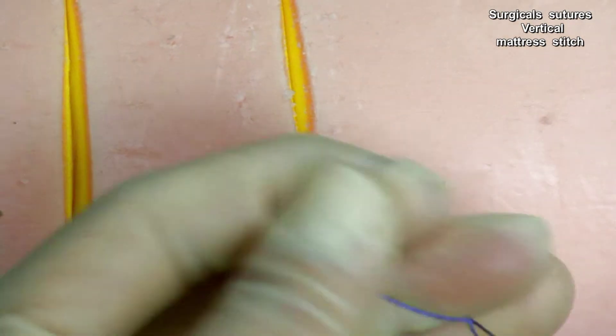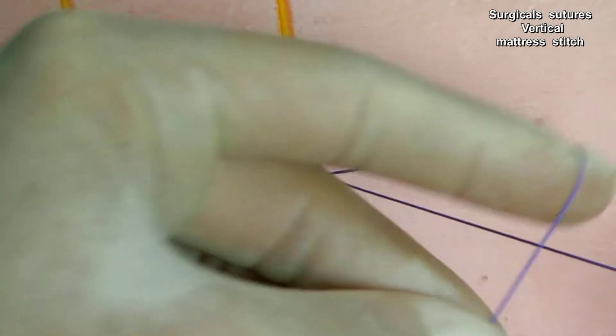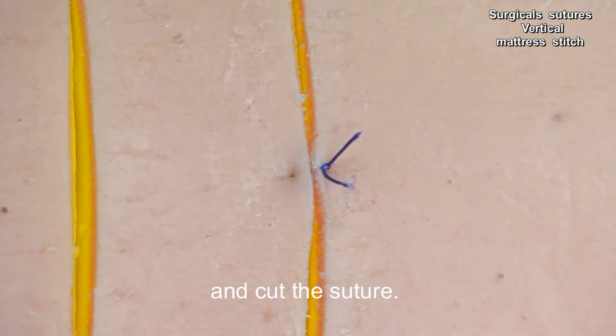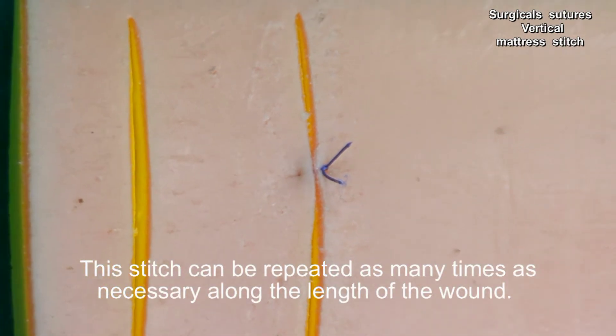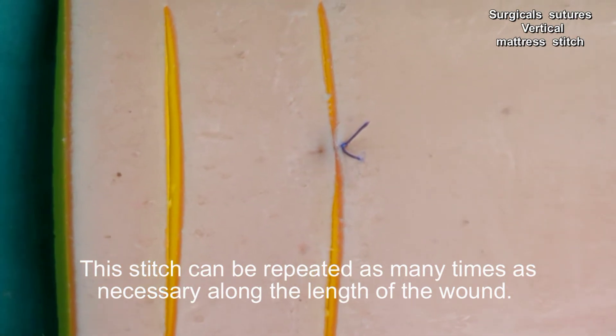We knot and cut the suture. This stitch can be repeated as many times as necessary along the length of the wound.